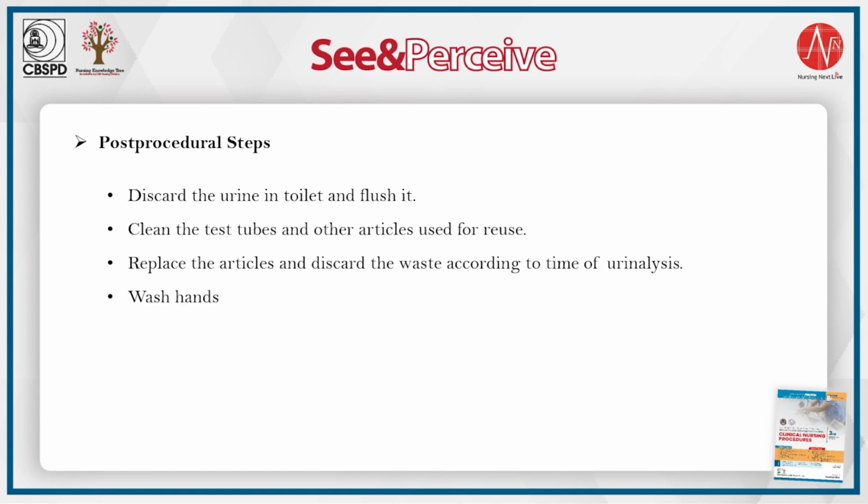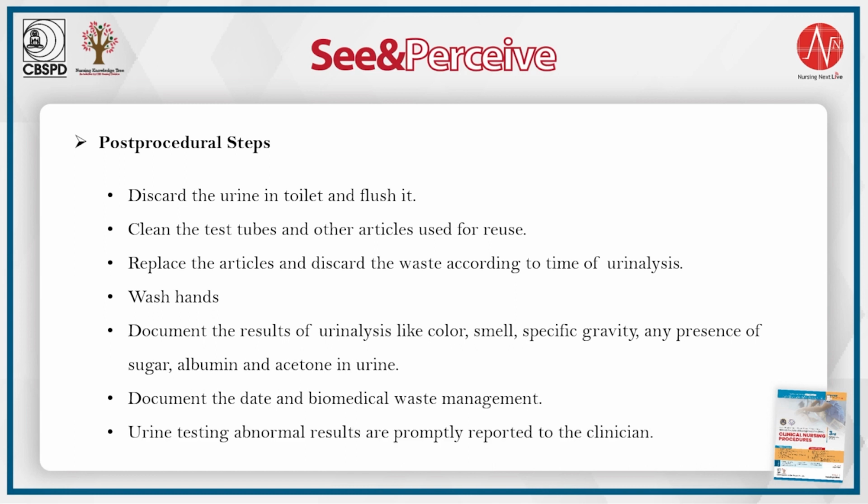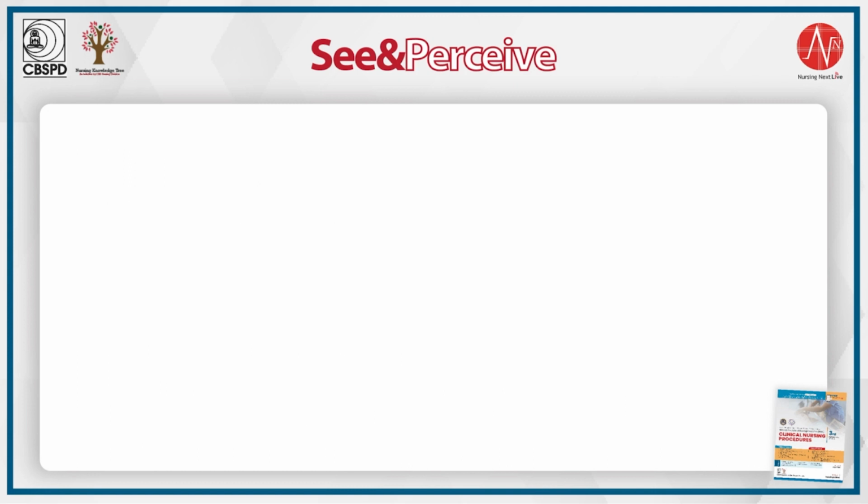Wash hands. Document the results of urine analysis like color, smell, specific gravity, any presence of sugar, albumin, and acetone in urine. Document the date and biomedical waste management. Urine testing abnormal results are promptly reported to the clinician.